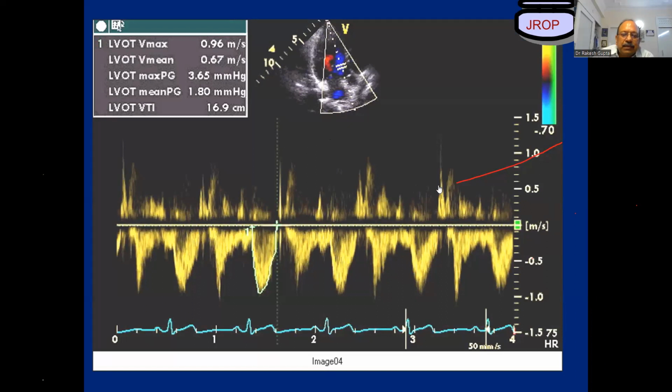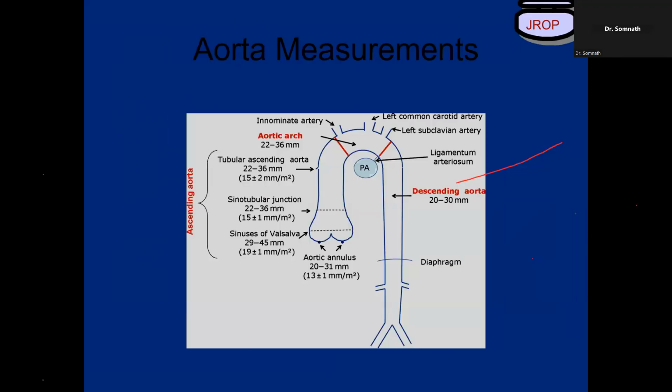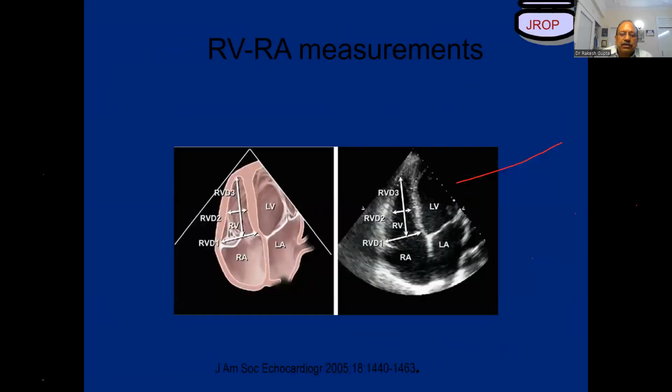Dr. Somnath. Hello. Go ahead, Dr. Somnath. Can you just enumerate or summarize all the basic M-mode measurements that are required, in which echo window to take them, and at what stage of the cardiac cycle to take those? All right. Just to summarize.